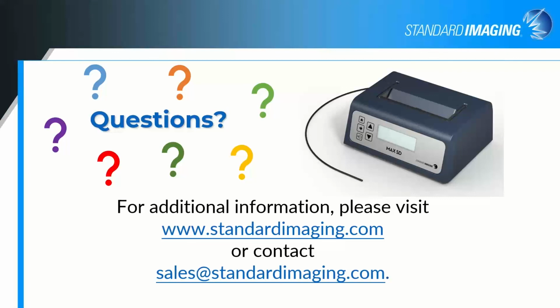Another question, what is the W3 and how does it differ from the W2? We don't have a W3 yet. So if you have suggestions of what you'd like it to be, definitely reach out. But the W1 is just the fiber and the optics. You need to use a 2-channel electrometer in order to do that Cherenkov subtraction.